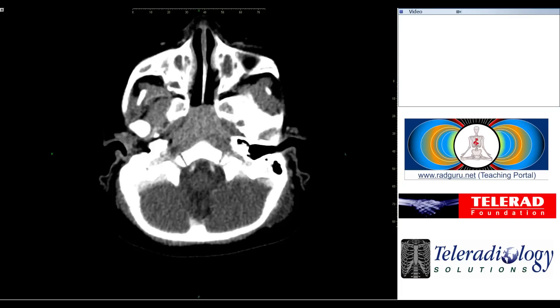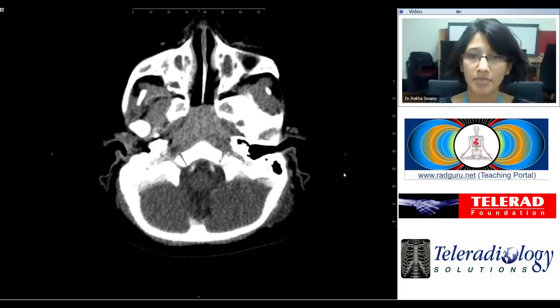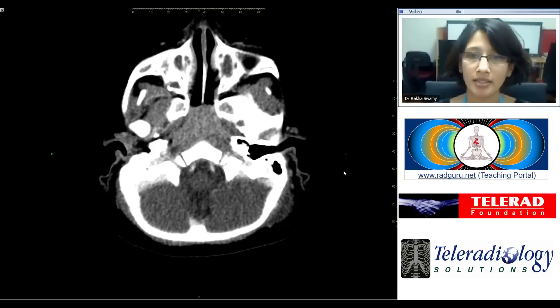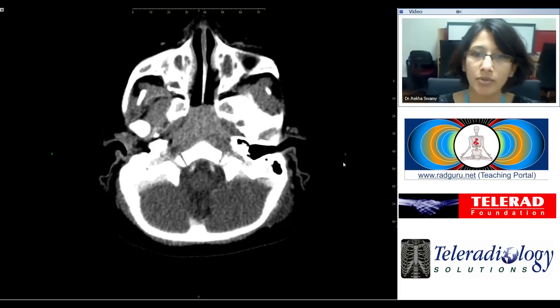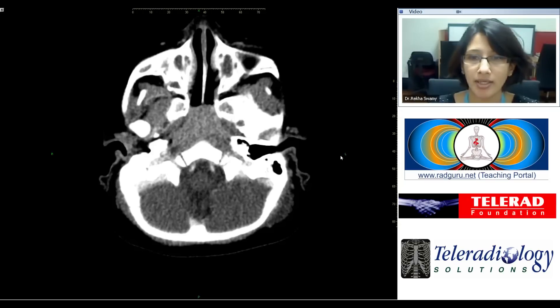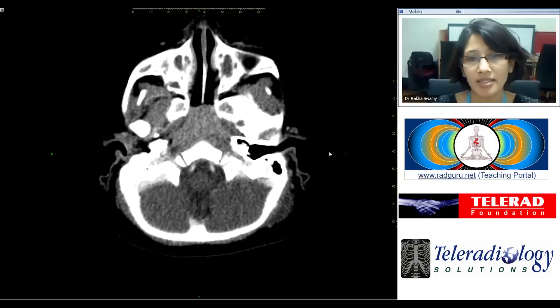Good afternoon everyone. I'll be presenting an interesting case of a young child who presented to the emergency department with a left-sided neck swelling. Here we have the axial contrast-enhanced CT scan in a soft tissue window.